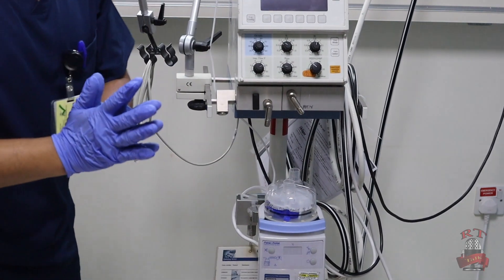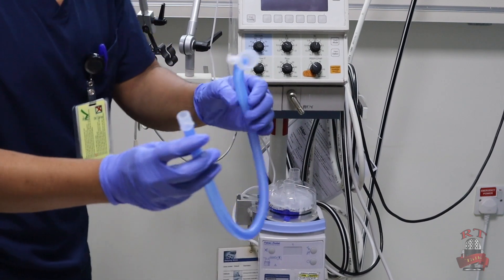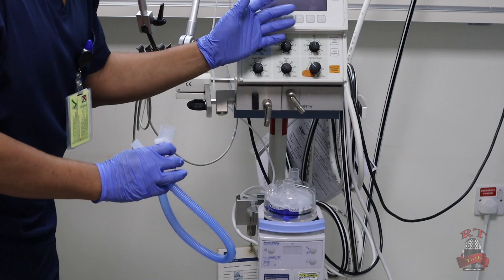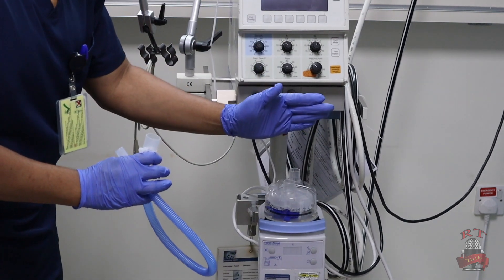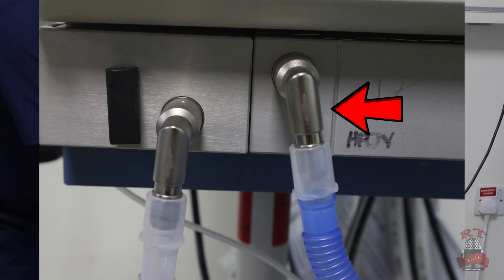I will start now connecting the circuit. I will take the inspiratory limb — the short one — and I will connect it in the adapter that comes from the machine going to the humidifier, as you see right now in the picture. Then connect it to the humidifier.